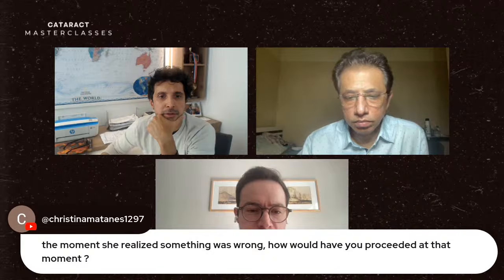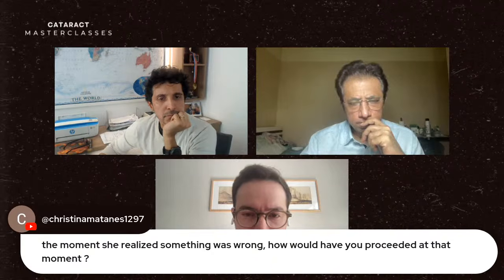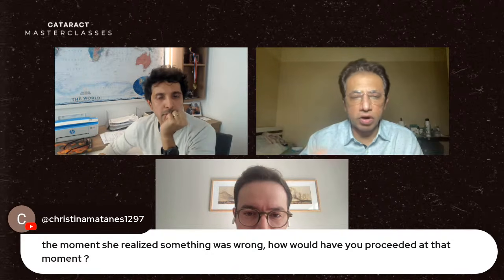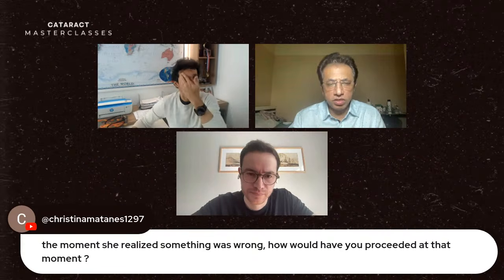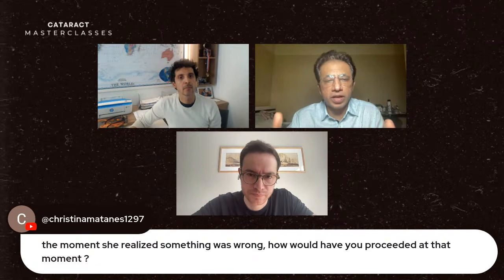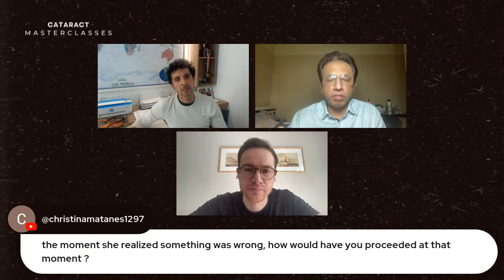Yes. The moment she realized something was wrong, how would you have proceeded at that moment? Convert, abort phaco. Even at the first notice, whenever you see that the torque is there, something is wrong, I would recommend a beginner surgeon to just abort the surgery, because what happens in an opaque nucleus, we don't know, we can't see the posterior capsule. So just convert to your manual SICS incision.